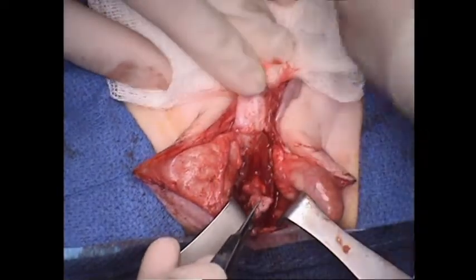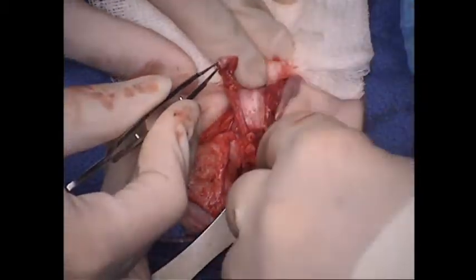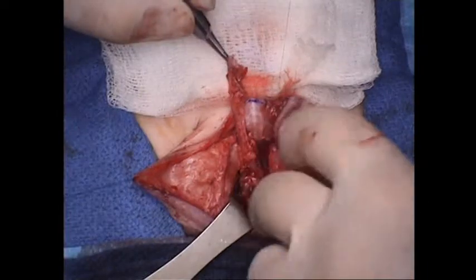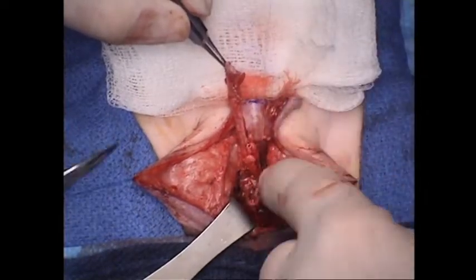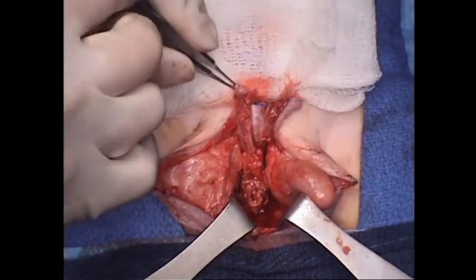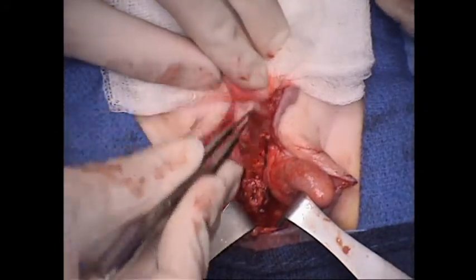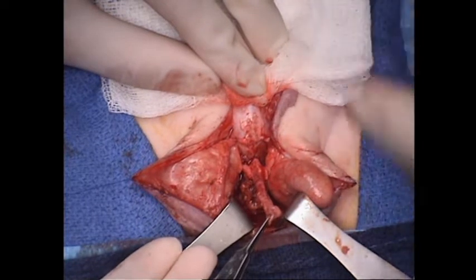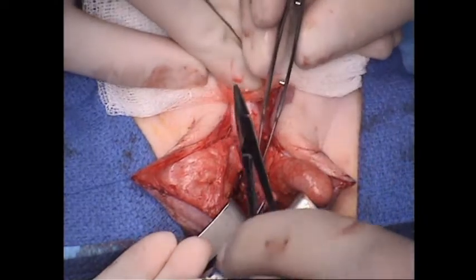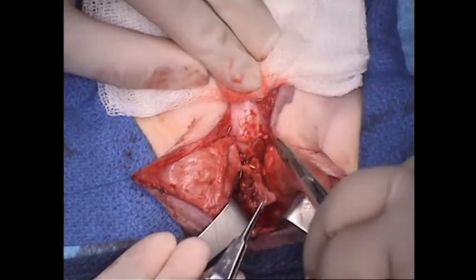All of that dissection of the urethra was to gain another centimeter in length and reduce the amount of graft. All the urologists are familiar with that because in training, you certainly would have seen a urethroplasty or a cancer operation where the urethra was dissected like this. And you know from urethral stricture surgery that the urethra can be mobilized all along the length of the penis for primary anastomosis without devascularizing it. We've not had a patient develop a stricture from this maneuver.